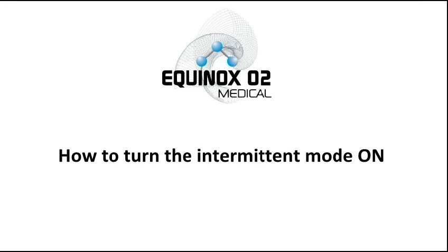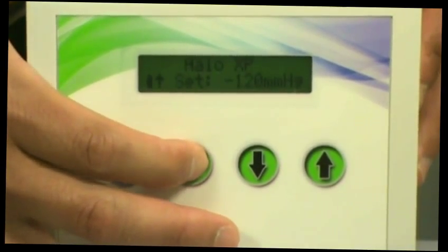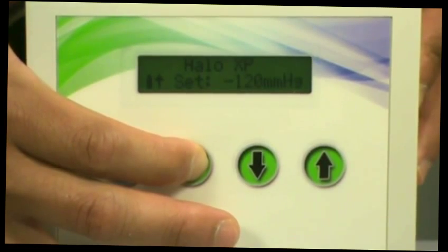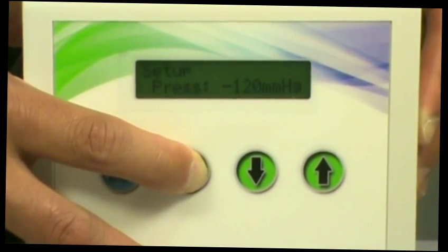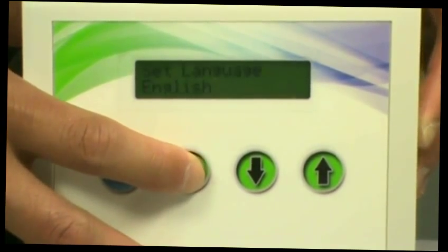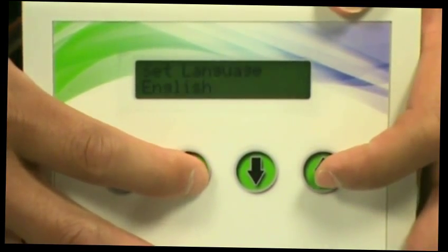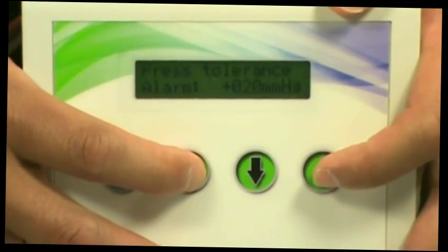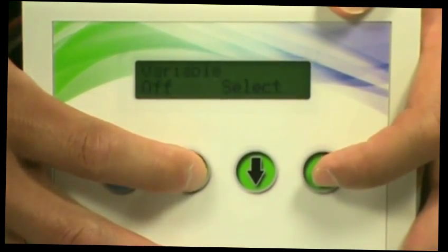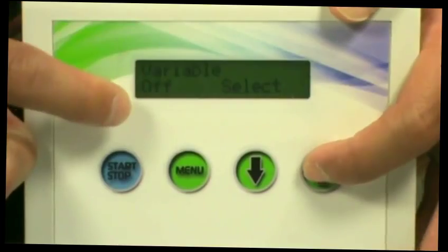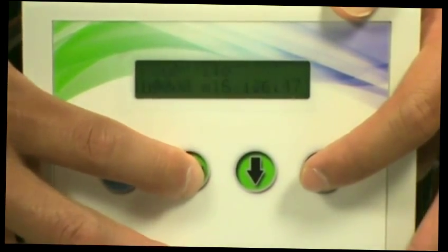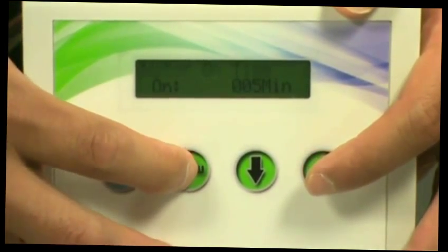How to turn the intermittent mode on. Press the menu button for ten seconds or until you reach the second menu option. Once you've reached the second menu option, continue to press menu until you've reached the variable option. Turn variable on and exit out of the second menu option.